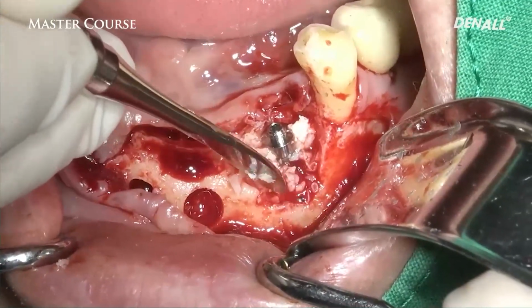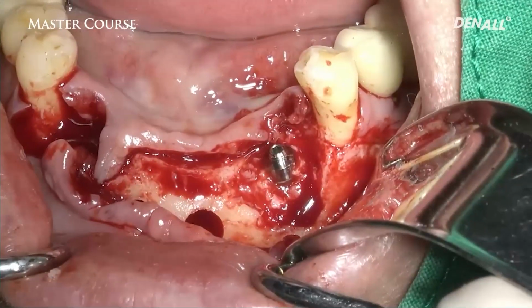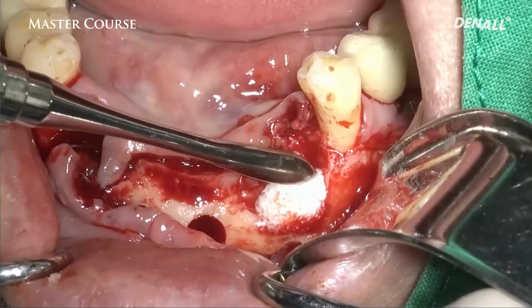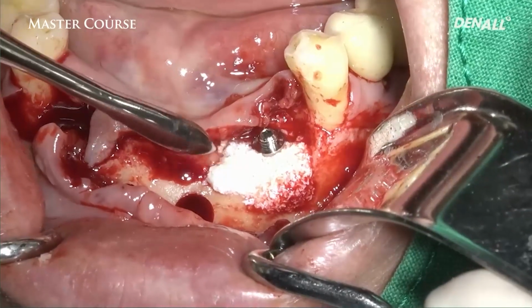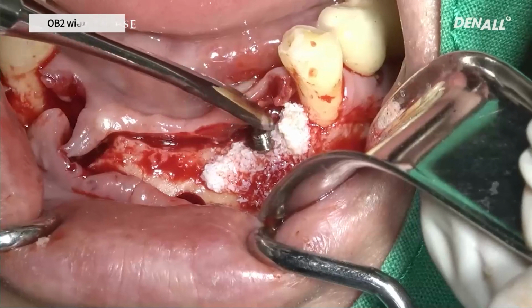In number 33, you can see that anchor is connected. As mentioned earlier, Ossbuilder is not directly connected to the implant, and there is a middle component called anchor. It is connected to the anchor first. The bone graft is done. In order to cover the bone graft, Ossbuilder is used.